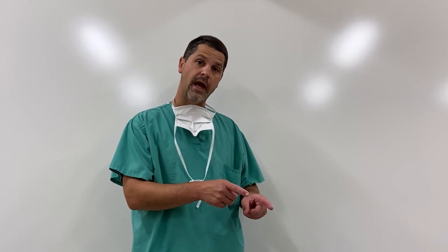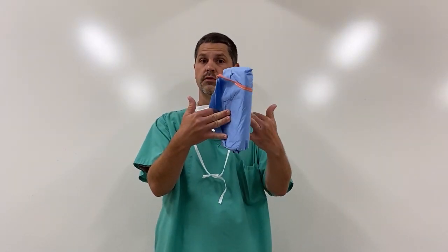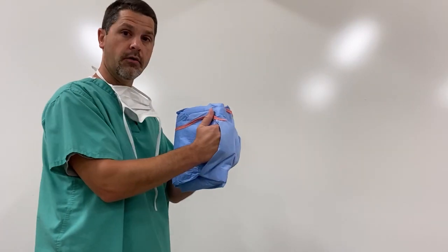Now this gets opened onto my table as well, and now I'm ready to get started. Gown goes on first, gloves go on after that. When I reach in, I can grab this gown pretty much anywhere, because what's going to be showing to me is basically what ends up being the inside of the gown — so everything you're looking at here is going to be on the inside and unsterile when you put it on. Feel free to just grab it out of the wrapper however you need to. Once you get it up, you can see there are little slots or tabs right here — those little wings are going to form the sleeves. So I take my hand, put it right inside here, and curve my hand around the gown, which allows me to hold it. Then I open the gown up with my hands still clenched like a fist, and when I'm ready I open my hands out — the gown drops down, and where my arms are becomes the sleeves. You just push your hands up and they'll go right down the sleeves.